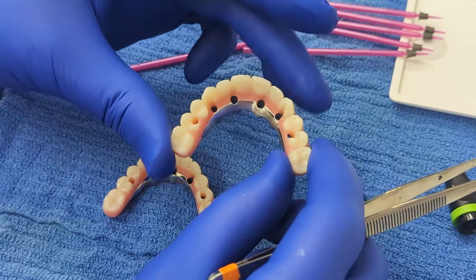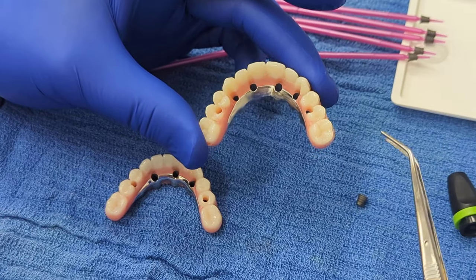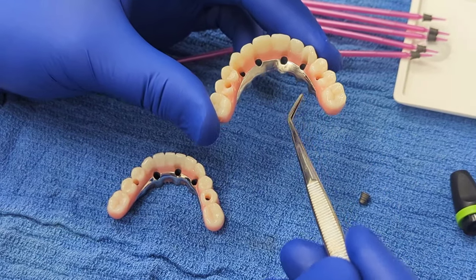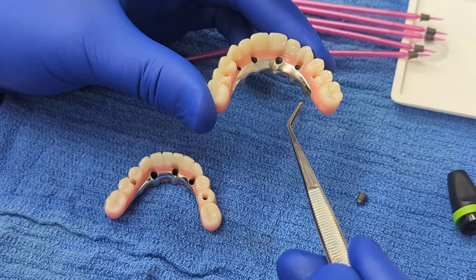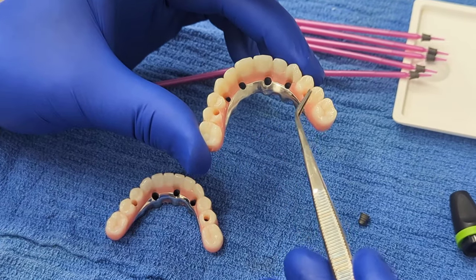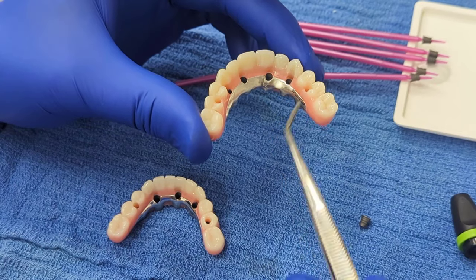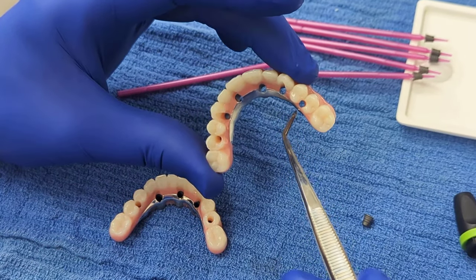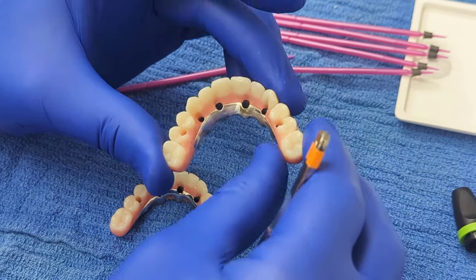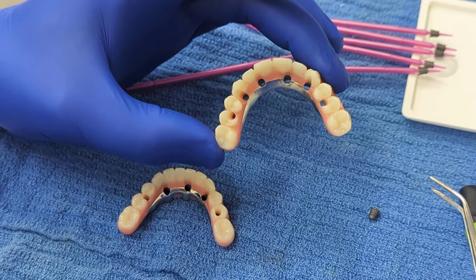If this was zirconia, again, zirconia is the strongest material out there. The problem with zirconia is that if you make it strong where it wants to flex here, you're making it super thick. And if you're making it thin so the patient doesn't get offended by it, this is where it's going to break. So zirconia does crack, it does break, and it usually breaks right through this thinnest area of a cantilever. So you can cantilever longer with a generation 4 hybrid than you can with a zirconia restoration.